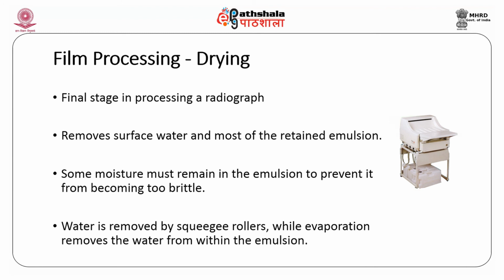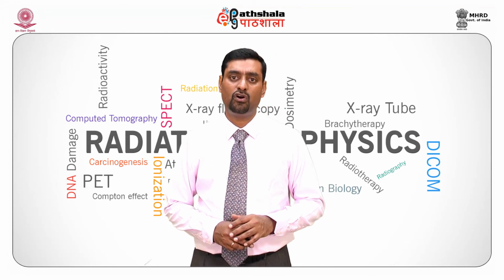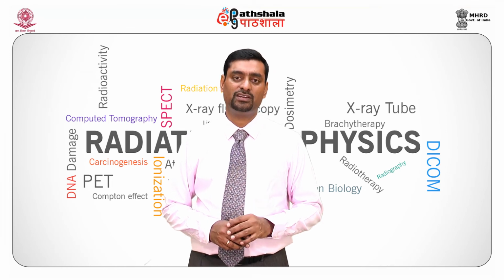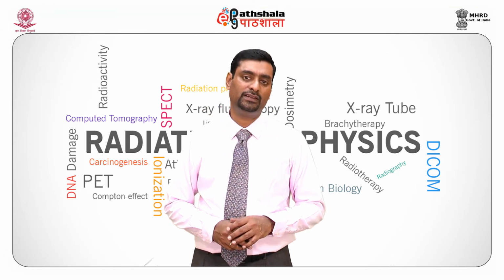Water is removed by squeegee rollers in case of films which are developed using an automatic processor, while evaporation removes the water from and within the emulsion. But in case of manual processing, it just dries up. We can also have a heated coil and a blower to dry these kinds of films. In some cases, they hang it under the fan for half an hour or so, and it dries up.